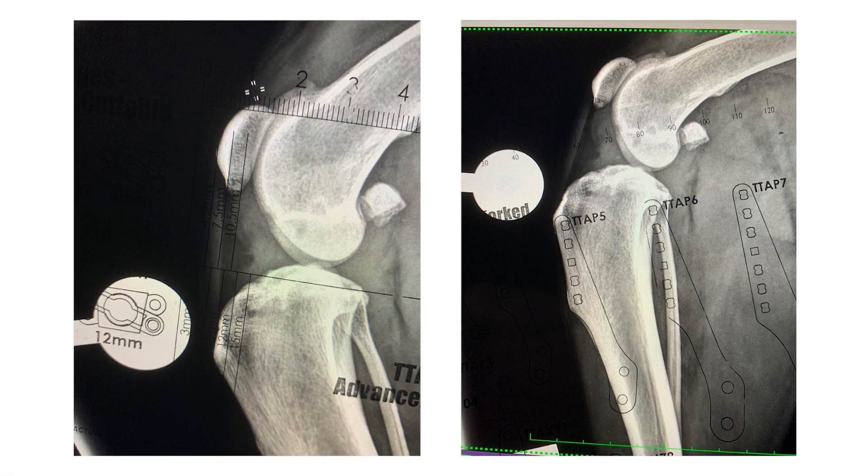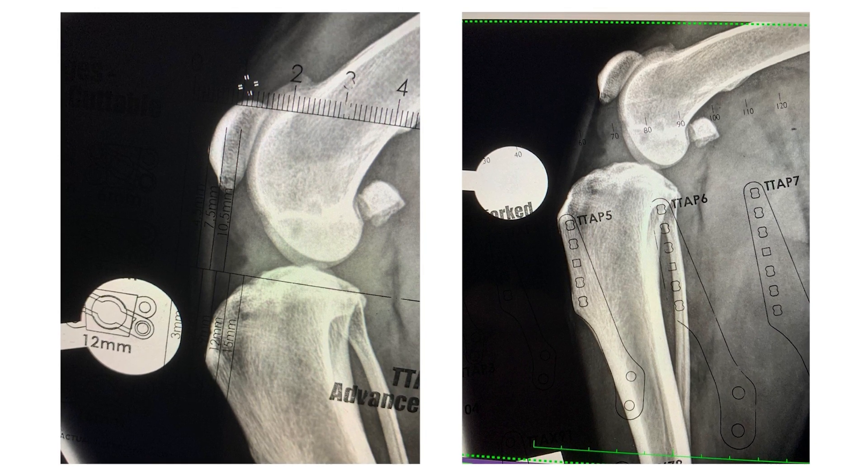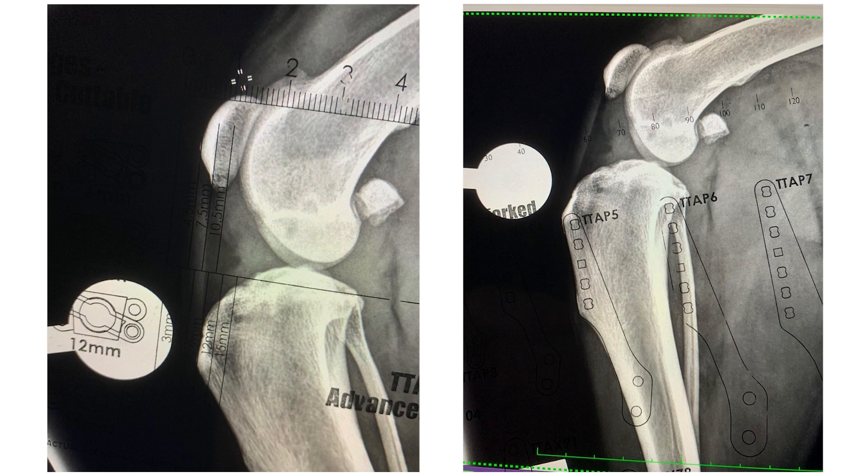Very accurate preoperative planning is essential, both to ensure correct positioning of the osteotomy and to determine the degree of advancement required.